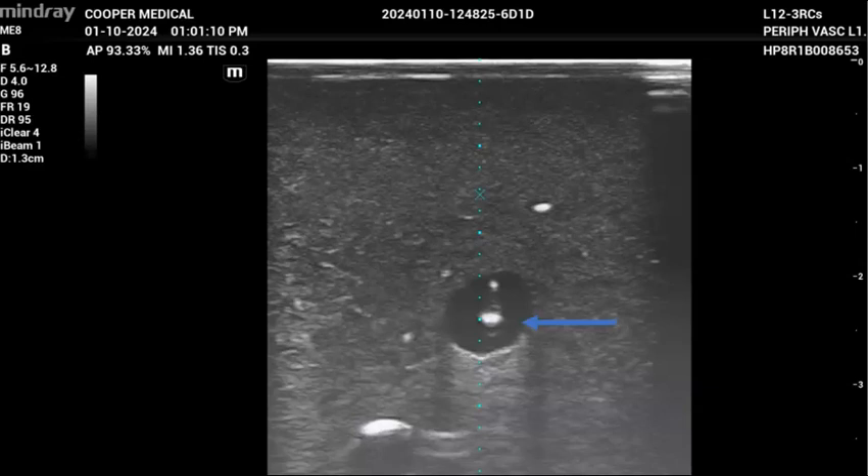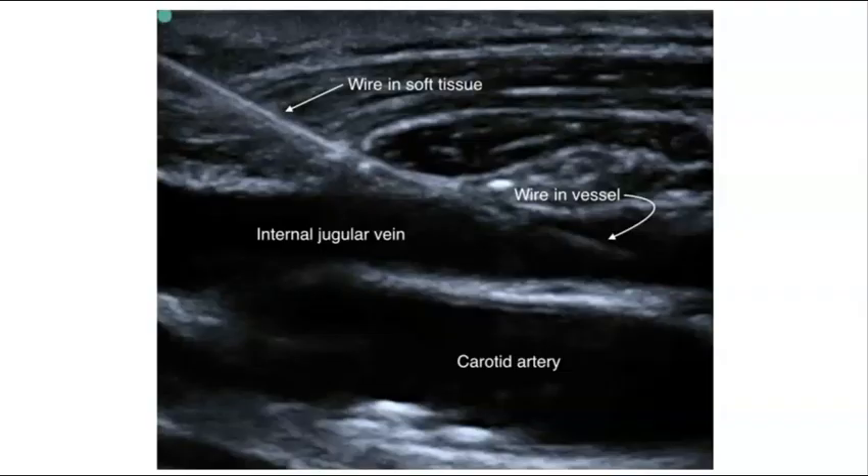At this point, you want to confirm again with ultrasound that your guide wire is in the IJ and not the carotid artery. You do this by looking at both the short and the long axis. In the image shown here, you can see that the guide wire is in the center of the lumen of the IJ as shown in the short axis. This image shows the wire in the IJ in the long axis. Ideally, you want to see both the IJ and the carotid artery on the ultrasound image to confirm that the wire is in the IJ and not the artery.